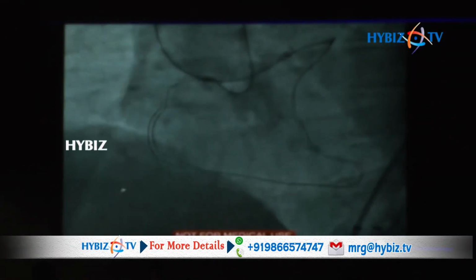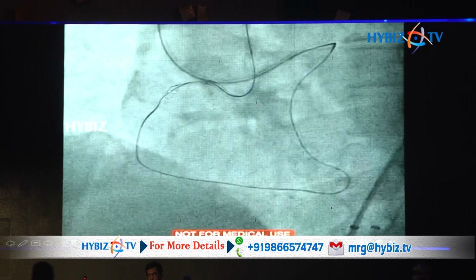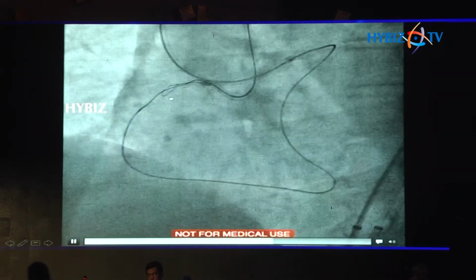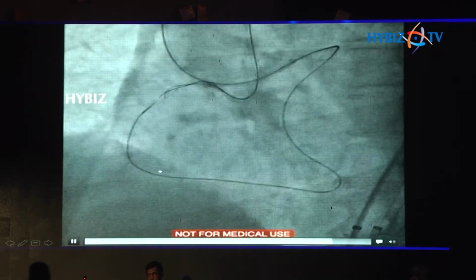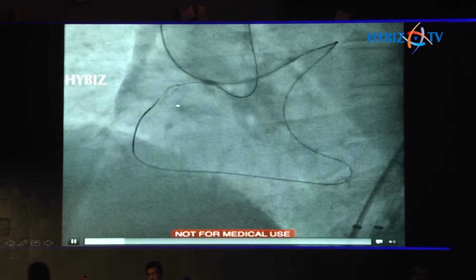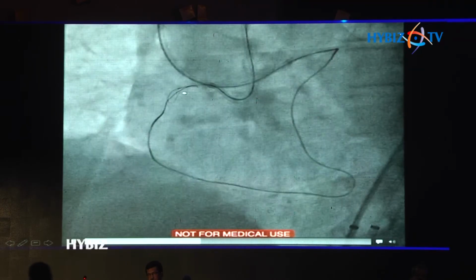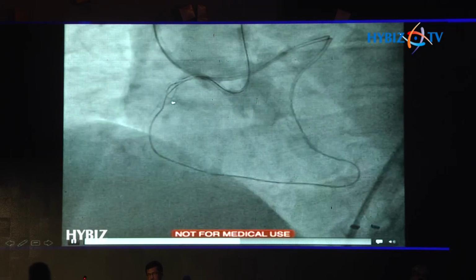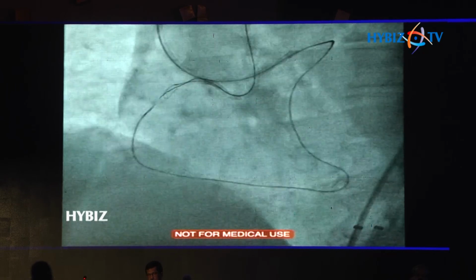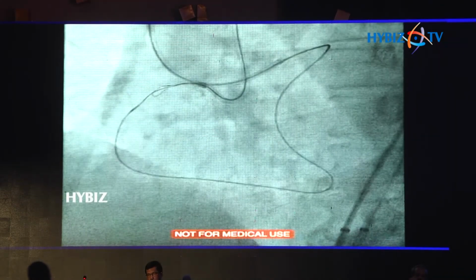Now, this was a case in which a scratching out technique was used, and a loop like this was formed. This loop could have been pushed down for subintimal tracking and re-entry, but always the preferable method is to just have a subintimal space like this inside the body of the CTO. Because if you go outside the body, usually hematoma occurs and it is uncontrolled. And so if there is an option for a reverse CART, it's always better to do a reverse CART like this.